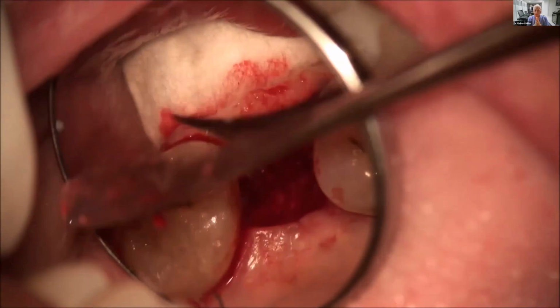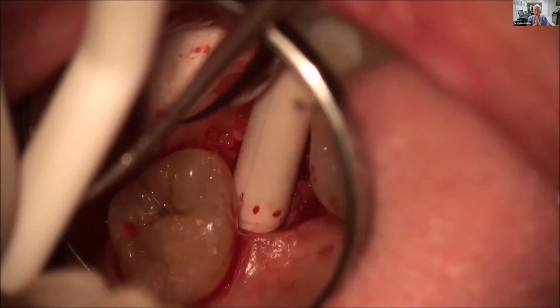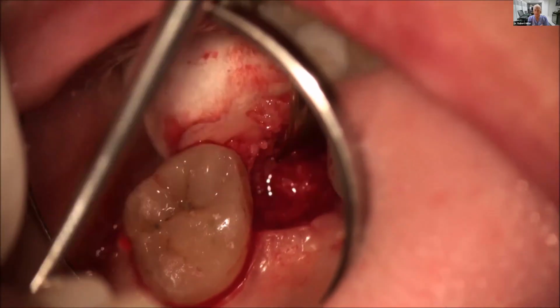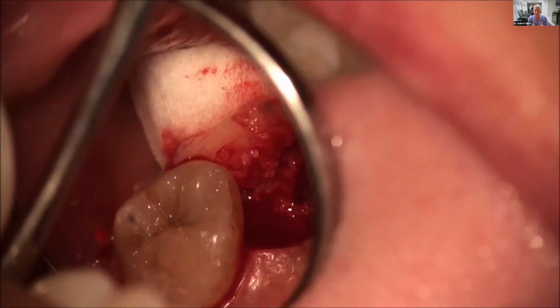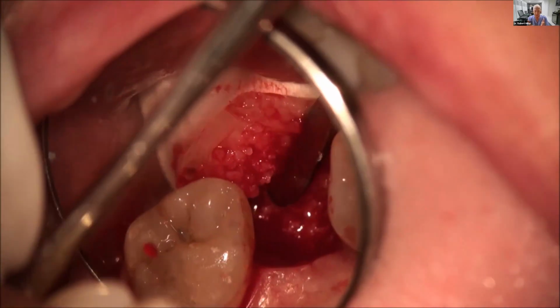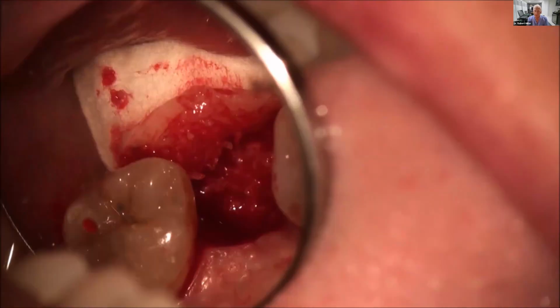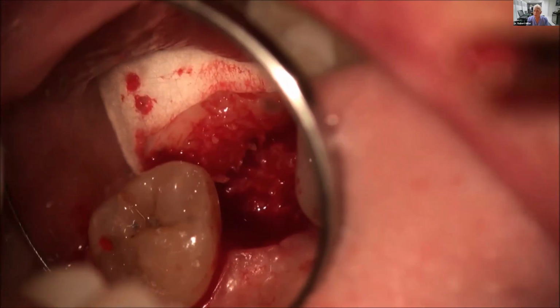As opposed to this. This is one of my cases. I re-entered after 4 months to find a whole lot of particulate left at the crest. I had beautiful primary closure, and yet when I re-entered, there's still a significant percentage of graft left. Now, what is this material? This is cortical, part of a cortical cancellous bone graft. So the cancellous component resorbed and was replaced, but the cortical component was not. And therefore, I ended up with a relatively poor percentage of vital bone.